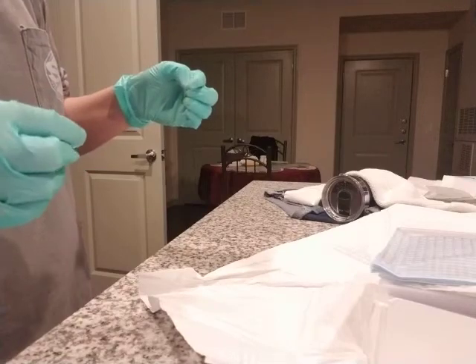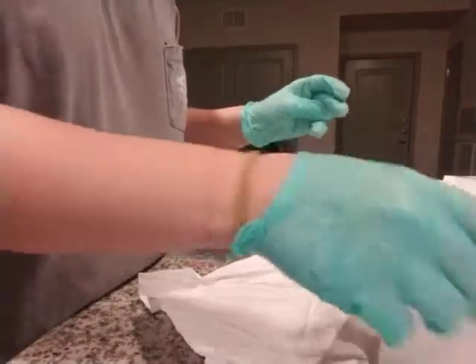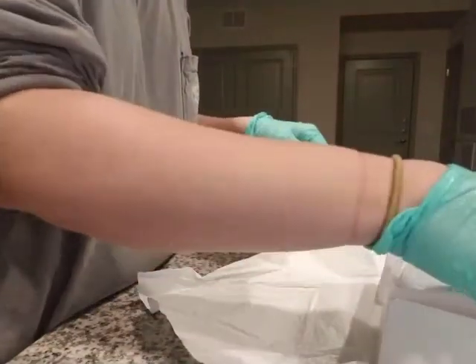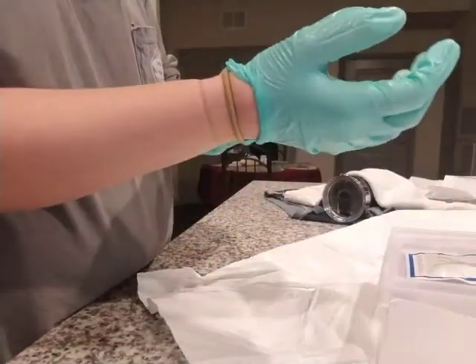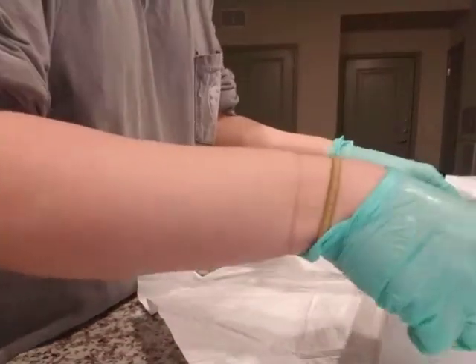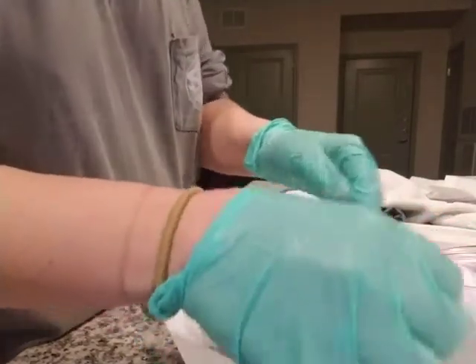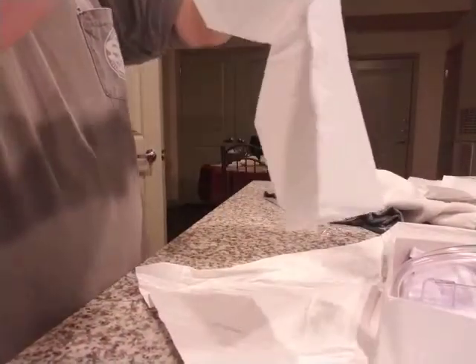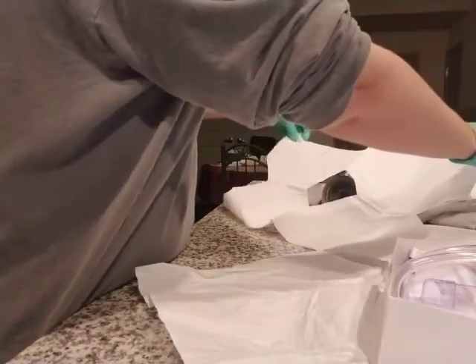And I'm now going to look at my equipment, and I want to maintain the integrity of my equipment. I'm also going to now apply a sterile drape to the patient, making sure I only leave the genitalia exposed.